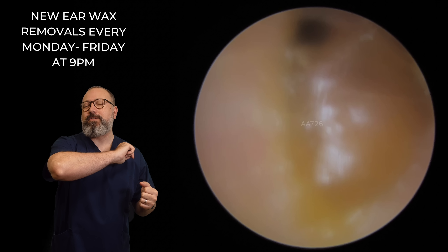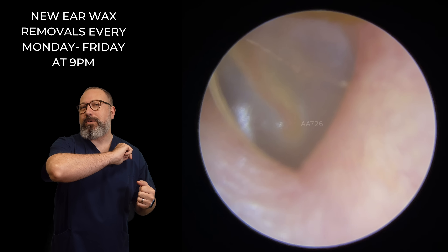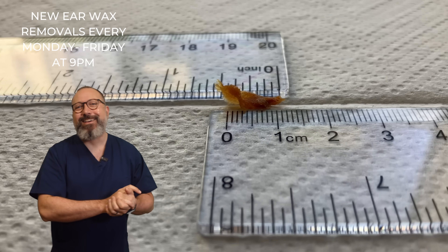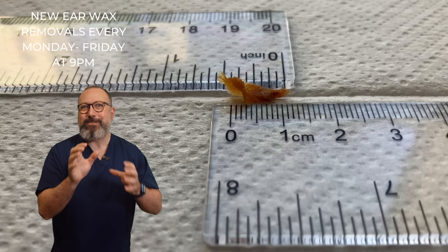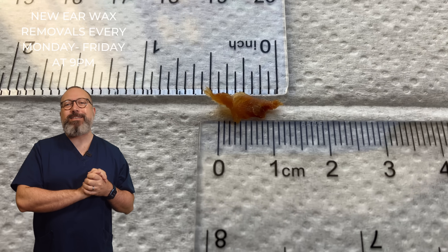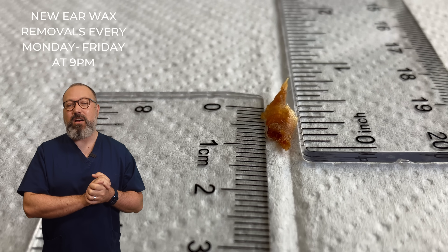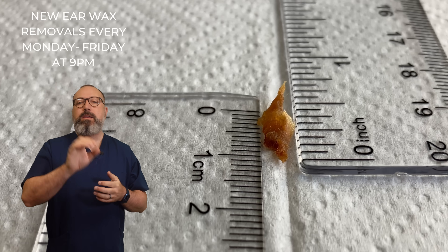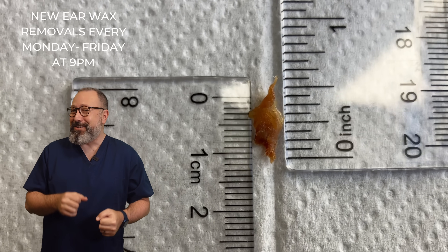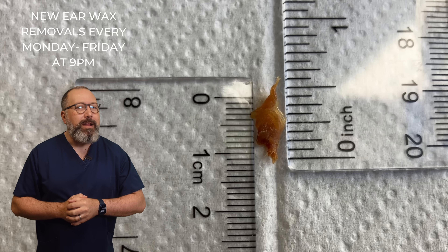Which eardrum is this — are we pointing to 1 o'clock or 11 o'clock? Going past the hairs in there — yes, it's a left eardrum. You can see it's just over one centimetre, just over half an inch of wax. It came out really easily and the patient can hear a lot better.